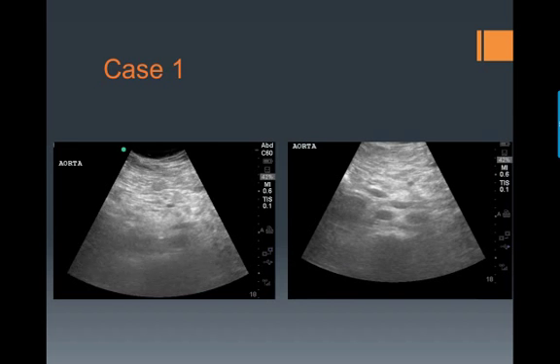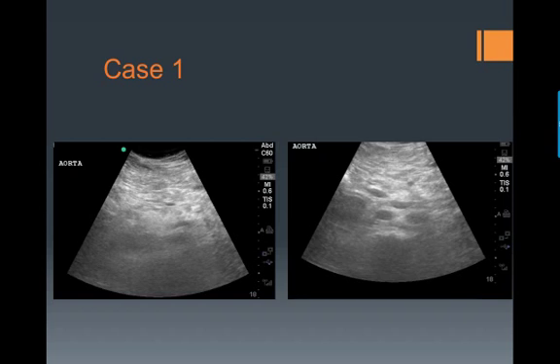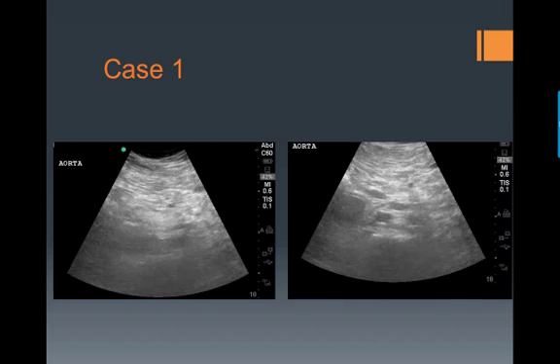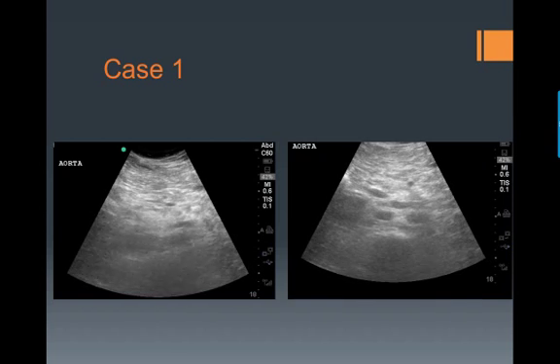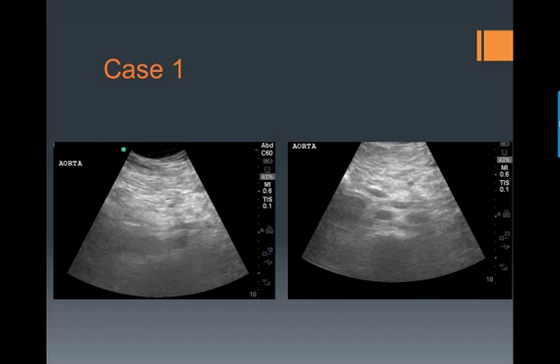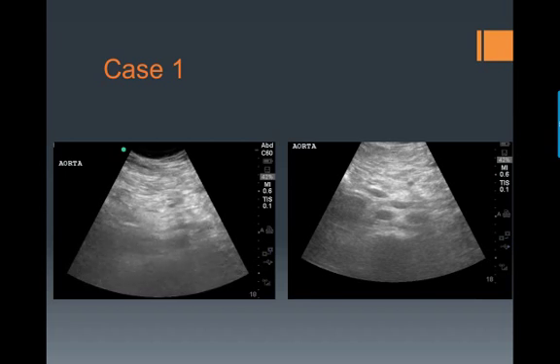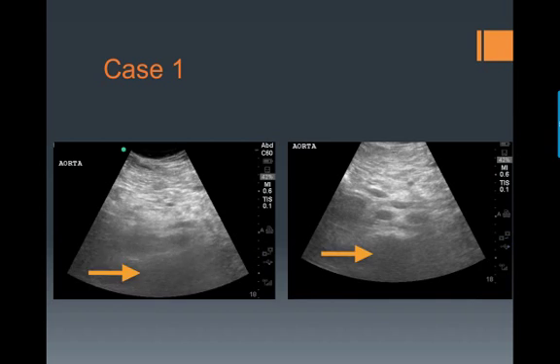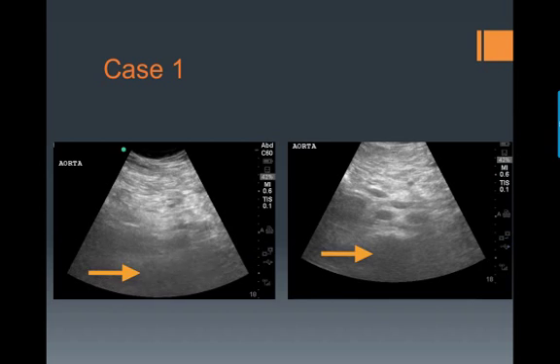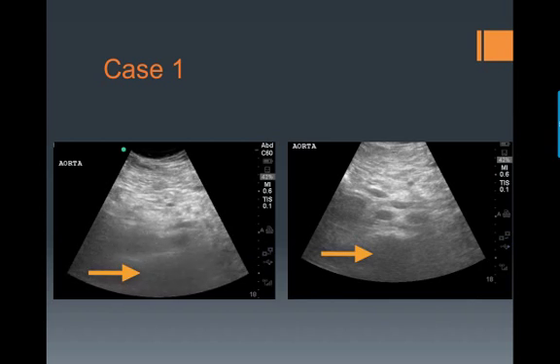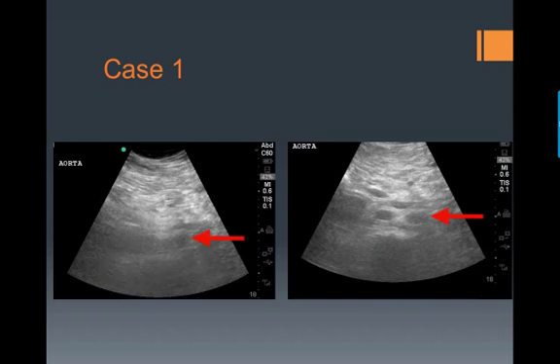Here's the ultrasound of this patient. It can be kind of difficult to identify the aorta on this ultrasound — this is pretty common. So again, first locate your vertebral body, and then you can begin to see your aorta to the right just above the vertebral body.